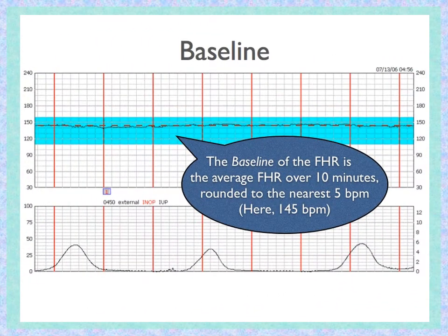This shows a baseline fetal heart rate. The baseline is measured between changes, so during this contraction, this would not be considered baseline. Between each one of these contractions, or between any accelerations, there are no accelerations on this, and any decelerations, there are no decelerations. So the fetal baseline would be what you would see between these contractions.